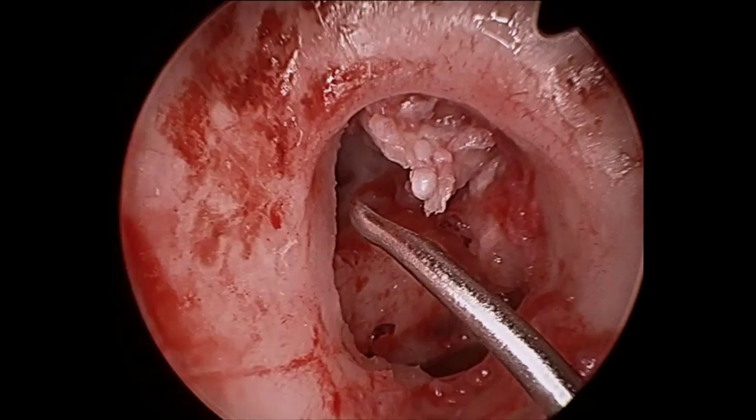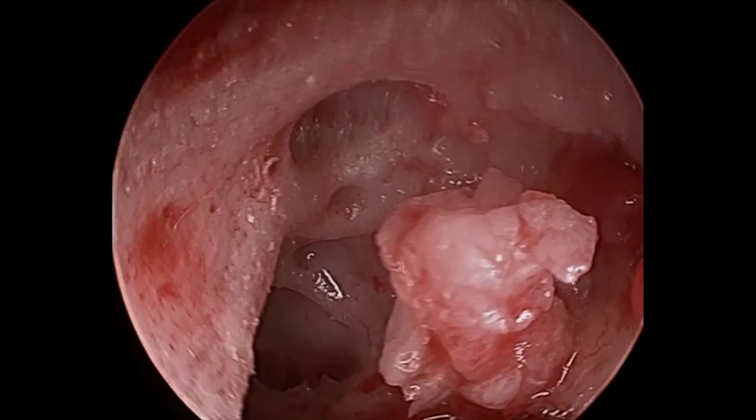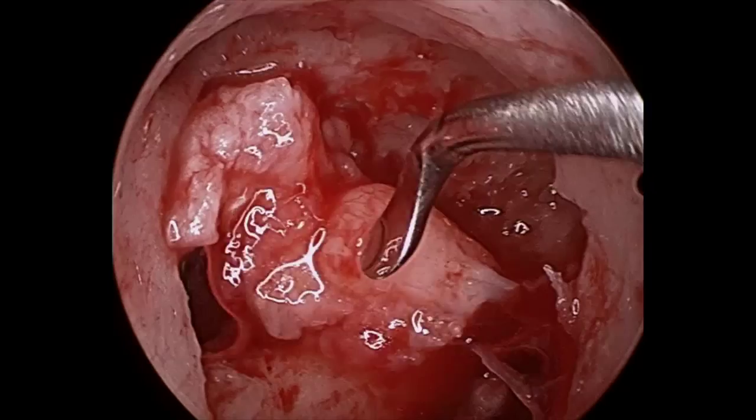The cholesteatoma is then dissected off the tegmen, or the middle cranial fossa floor, and finally anteriorly off the incudomalleolar complex. The anterior malleolar ligament is divided with scissors and the sac is completely removed.